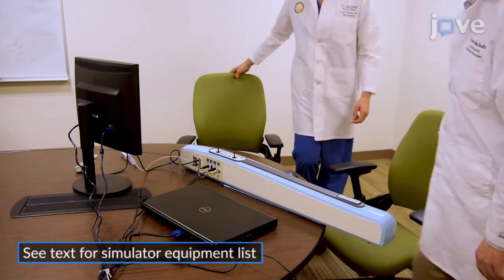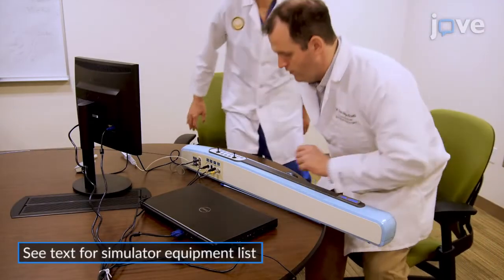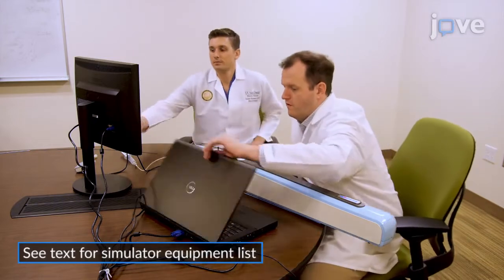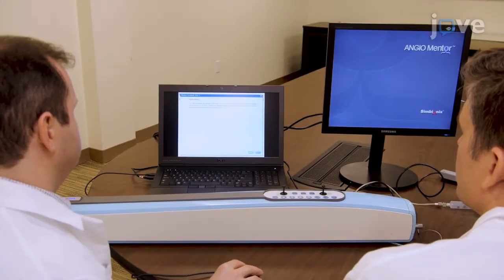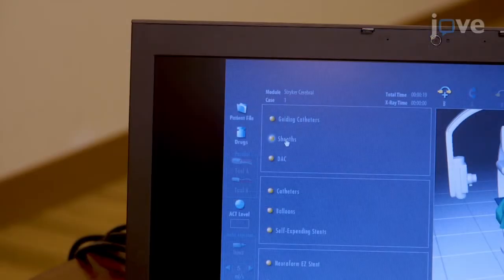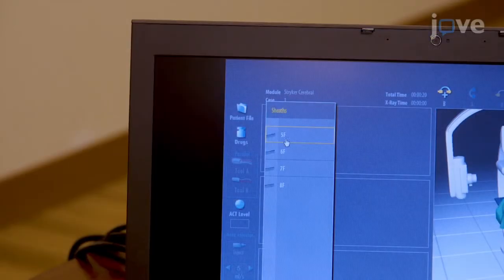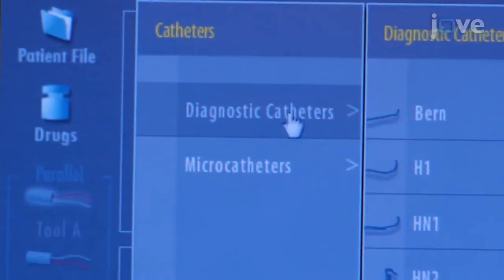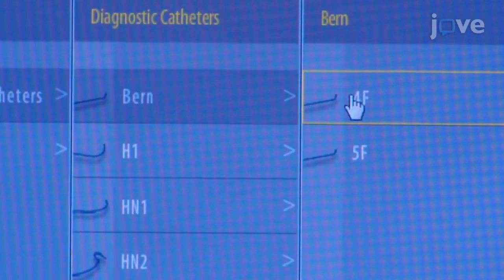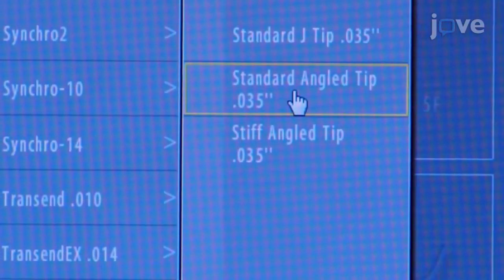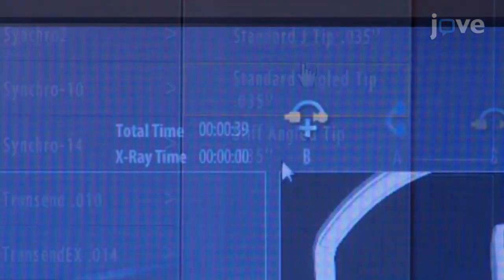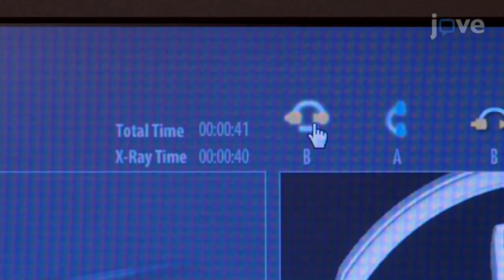Before beginning a procedure, assemble and power on the simulator. Select the patient scenario in the software interface on the attached laptop and select the appropriate arterial sheath size from the drop-down menu. Select the appropriate catheter, guide wire, and/or microsystem based on the specific scenario, and turn on the A and B plane.